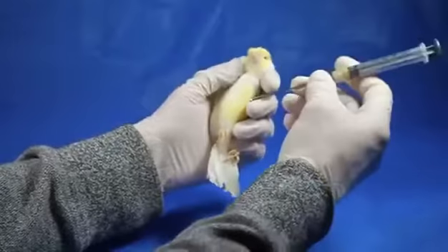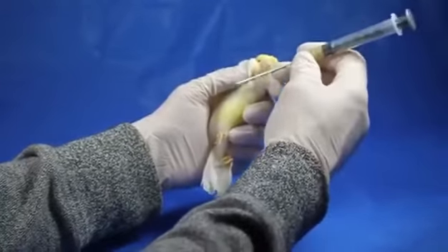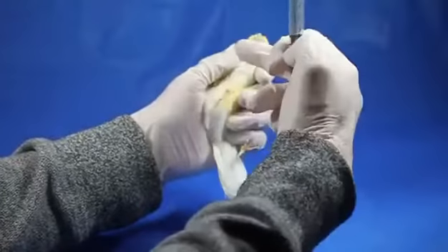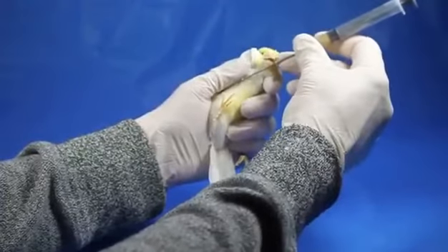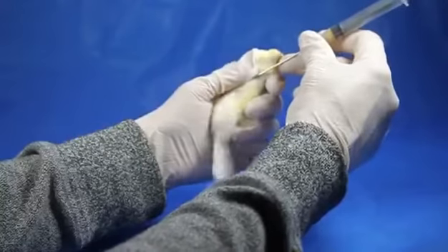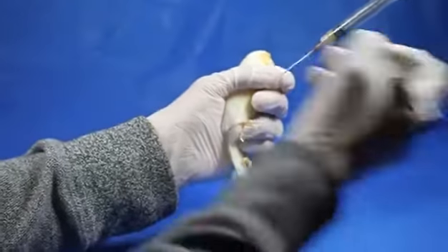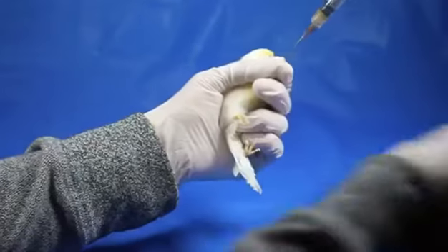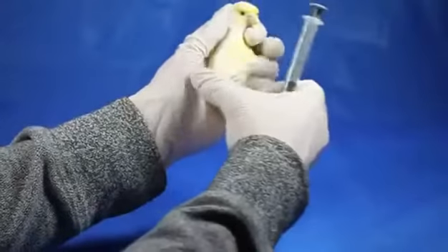The first thing we're going to do is measure the length of how far we're going to insert the needle. You do that by taking approximately where the crop is — right here — and taking it from this side of his mouth down until you hit that location. I'm going to take a permanent Sharpie marker and mark on the tube where I want to insert the tube to.